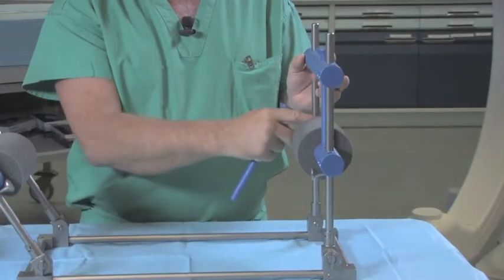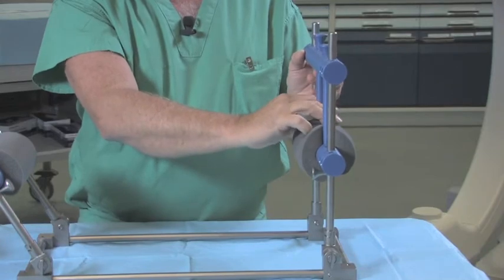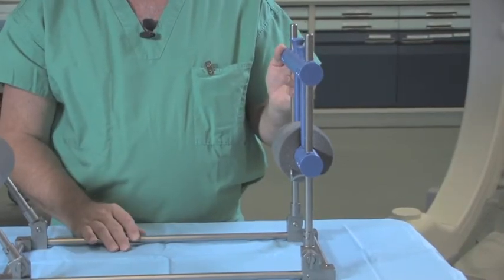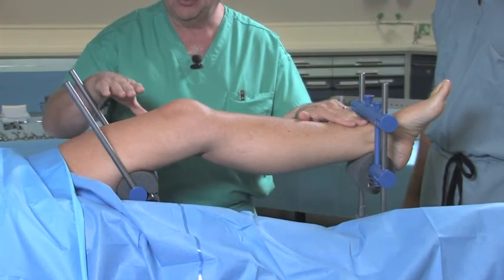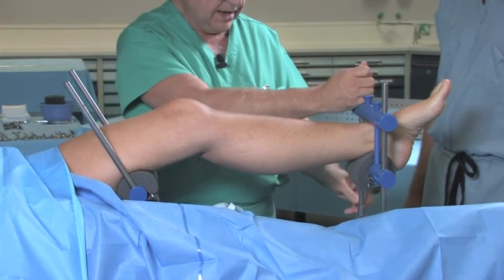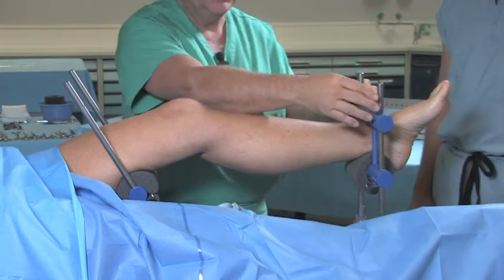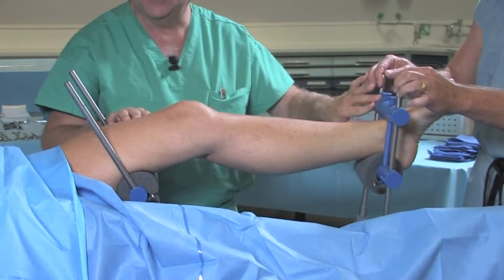You can move the foot and ankle into an anatomic position, secure the two blue T's around it, and now you can strain the foot for traction and rotational control. The body of the proximal femur acts as a counterweight, the proximal blue support bar acts as a fulcrum, and by loosening the thumb screws 360 degrees on both sides, we can have our assistant grab both goalposts and start placing the leg under traction.